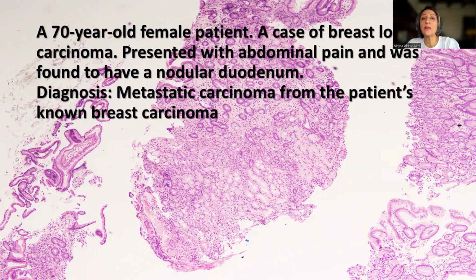If there is lymphovascular invasion, that would be even more helpful. And always apply GATA3 immunohistochemistry to those cases, because you will be surprised. Very often those cases can be missed because of the deceptive bland appearance and their intermingling with inflammatory cells, which would really mask their malignant nature.